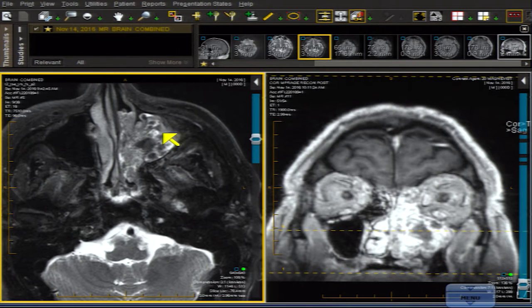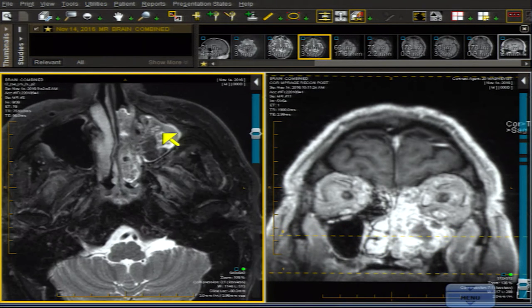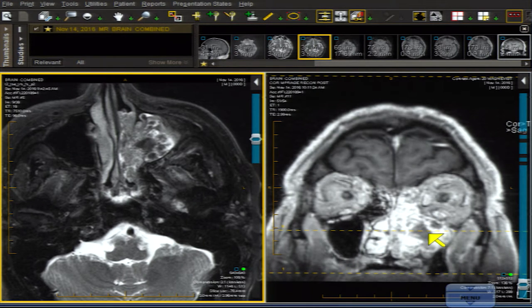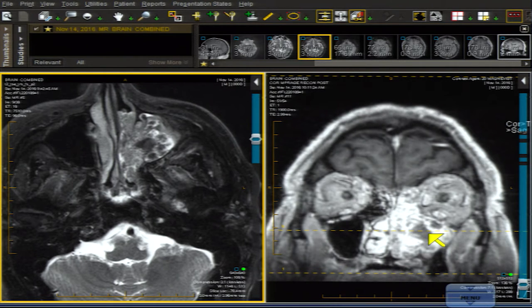On the axial projection it has a somewhat unusual convoluted appearance. The differential diagnosis of tumors in the maxillary antrum is pretty limited — the most important would be squamous cell carcinoma, which is very difficult to differentiate from its look-alike, the inverting papilloma. They are related: about 11 percent of inverting papillomas are reported to have squamous cell carcinoma, though our experience suggests it's much more frequent — 50 to 60 percent even.